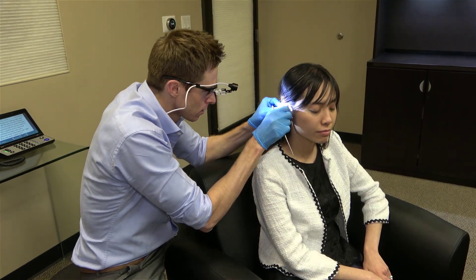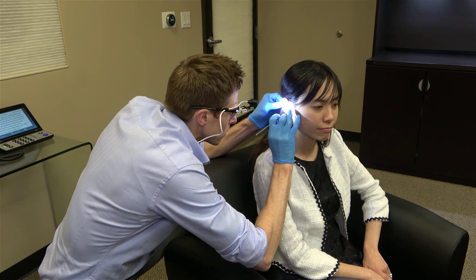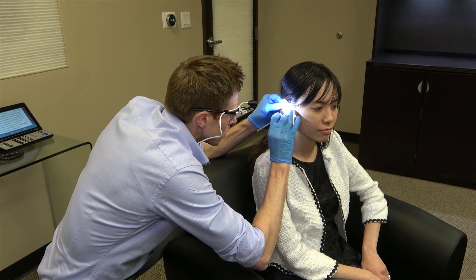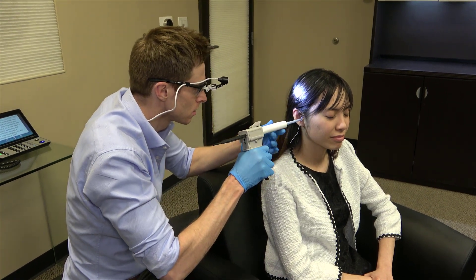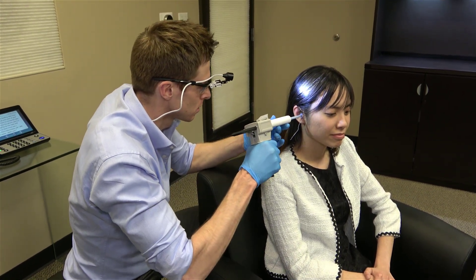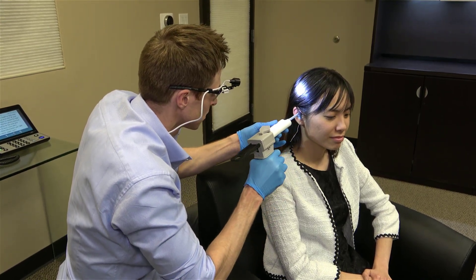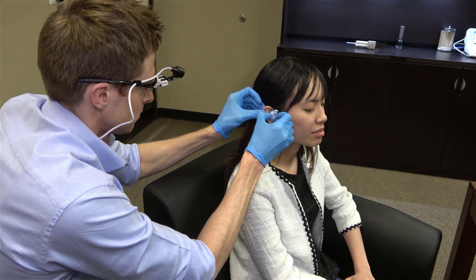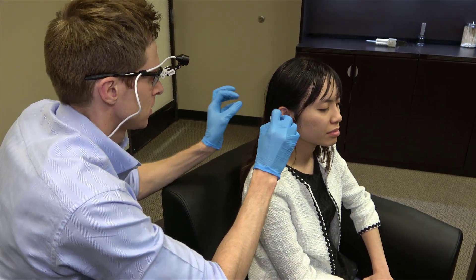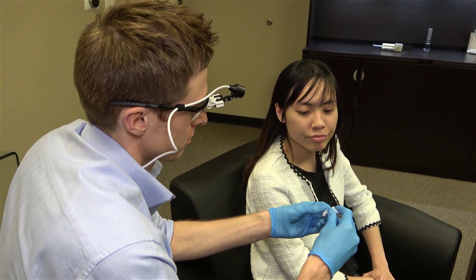Traditionally, ear mold impressions are performed by first placing a foam block inside of your ear canal at the depth that we want the impression material to stop at. We then mix together a variety of different compounds that we inject inside of your ear canal, ensuring that we get impression material into every small contour of your ear. After a few minutes, that compound will harden and take the shape of your ear. We then mail these impressions off to an ear mold lab or hearing aid manufacturer and wait for the custom product to arrive.